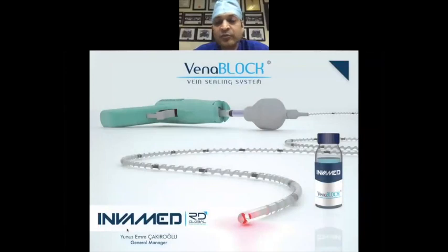Then there is a glue you can use, a Medtronic glue which is available. Then there is Invamed glue which is available. You can use any one of them. The difference is Invamed has a faster polymerization rate. Medtronic has a slower polymerization rate. There is a lot of experience with both the glues, a lot of publications.